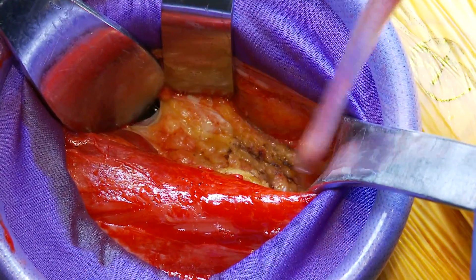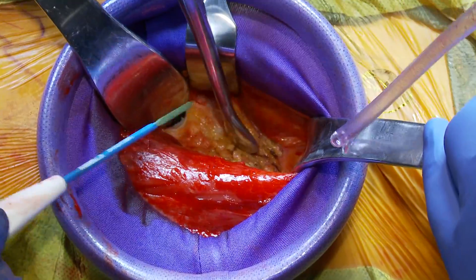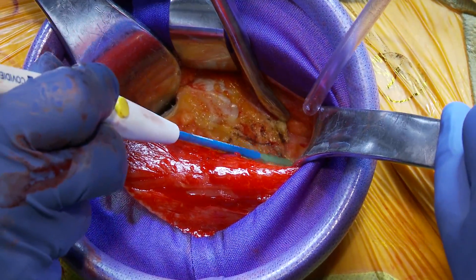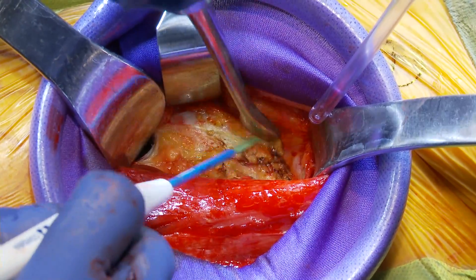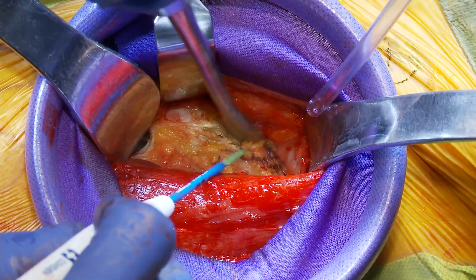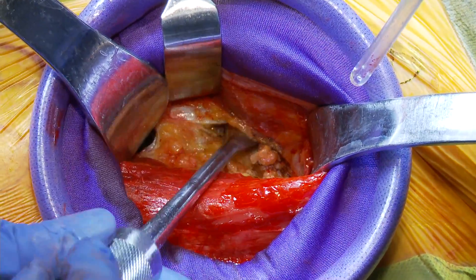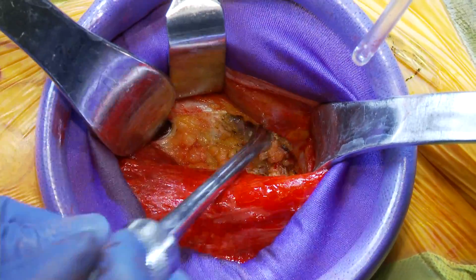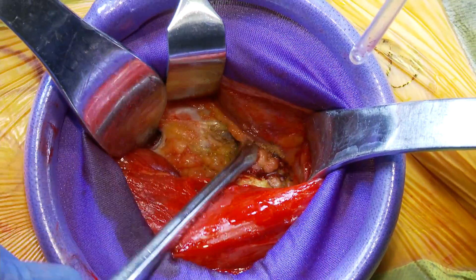When we get below the rectus femoris and mobilize it medially, you'll start to see the iliocapsularis muscle — a muscle that lies right on top of the anterior capsule. Deep to the rectus femoris you can see fibers of the iliocapsularis. I'm trying to really stay on top of the capsule here and I'll use this elevator to develop that plane before taking a curved acetabular retractor.